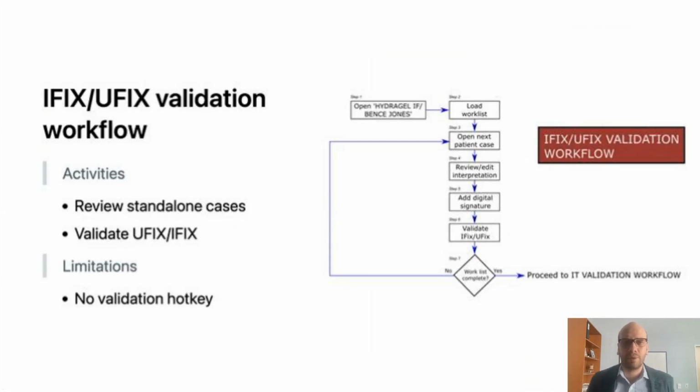Next, the pathologist needs to go into a separate workflow, opening a different program, in order to validate the immunofixation studies, as well as review any standalone cases. We do occasionally receive requests for isolated immunotyping studies, typically coming from neurology. This is a pretty quick process.